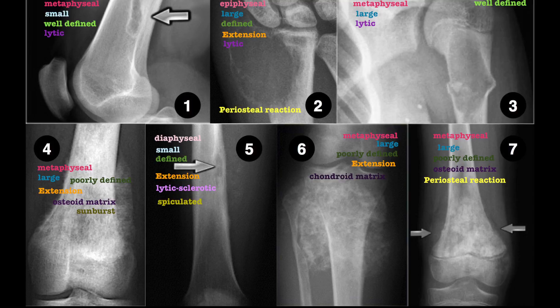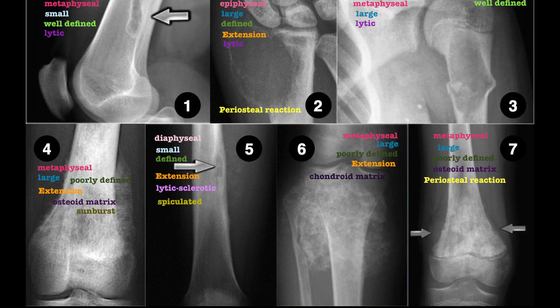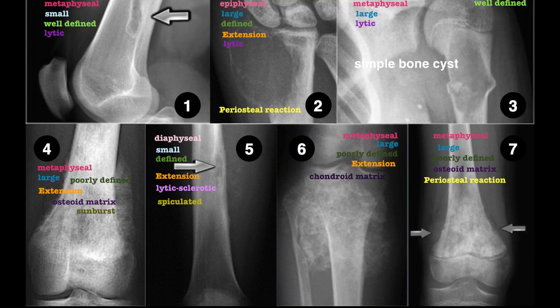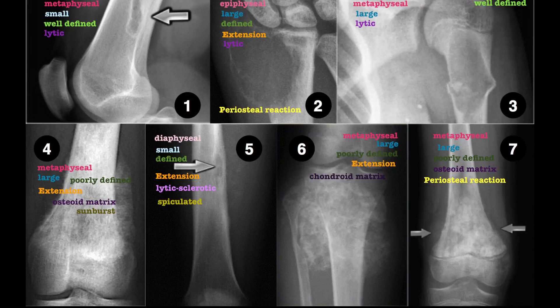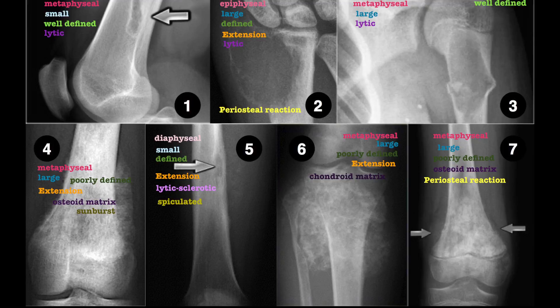As previously mentioned, the tumours in the top row are all benign. Benign tumours are well-defined, sclerotic, less extensive, and usually do not interrupt the periosteum. Figure 2 is an exception, as it is an aggressive type of benign tumour. Benign tumours are usually classified as latent, active or aggressive. Tumour 1 is a non-ossifying fibroma, tumour 2 is a giant cell tumour, and lesion 3 is a simple bone cyst. The bottom row are malignant tumours — typically ill-defined, large, extensive lesions with a periosteal reaction. Figures 4 and 7 show an osteosarcoma, figure 5 shows a Ewing sarcoma, and figure 6 shows a chondrosarcoma.